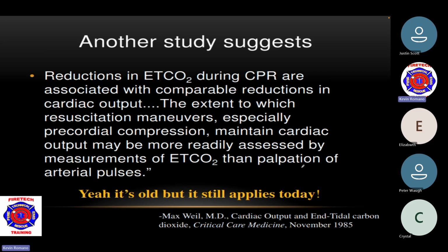Another study suggests reductions in end tidal during CPR are associated with comparable reductions in cardiac output. The extent to which resuscitation maneuvers, especially precordial compression, maintains cardiac output may be more readily assessed by measurement of end tidal than palpation of an arterial pulse. Yeah, it's old, but it still applies today. Underline here, November of 1985.